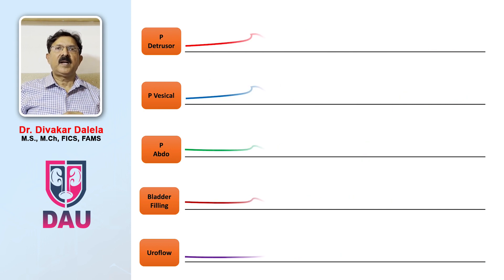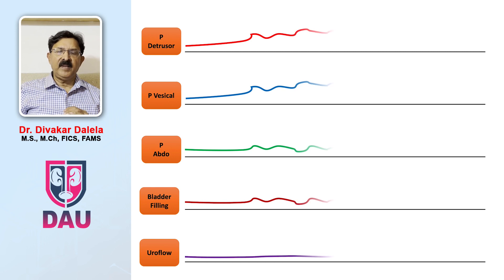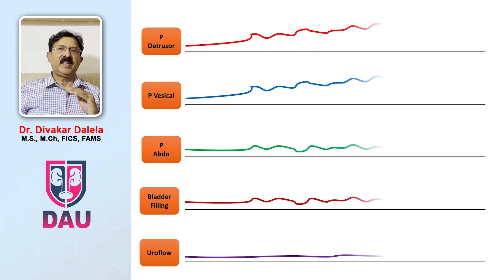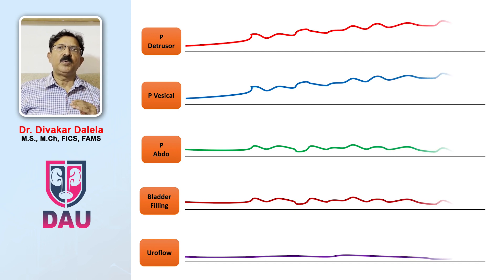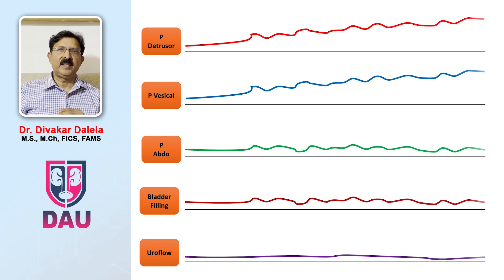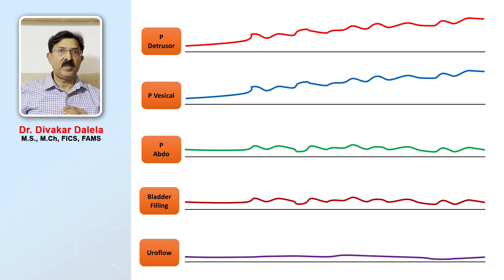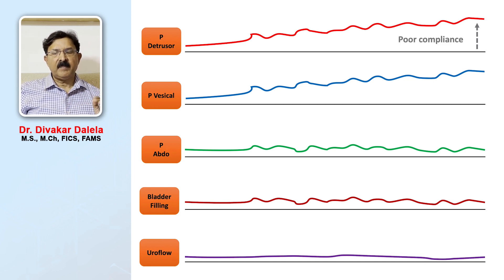In the third example, you see the bladder filling going up and as the bladder fills, you notice the pressure line rising slowly and consistently. The P-vesicle is rising, the P-detrusor is rising and going higher and higher till the end of the filling. When you get this kind of graph, this is indicative of poor compliance of the urinary bladder. You can of course calculate it by a mathematical formula, which we will tell you later.